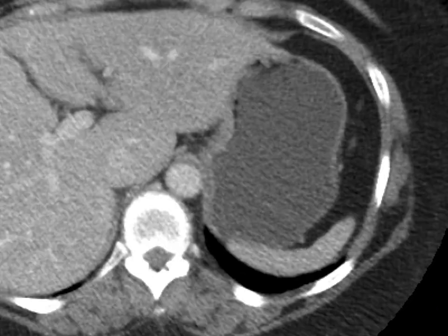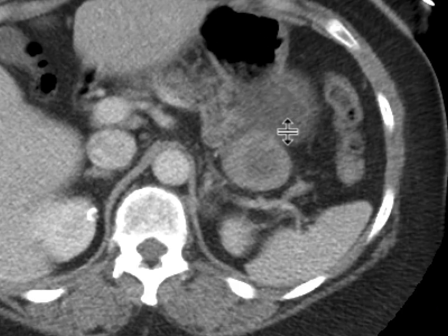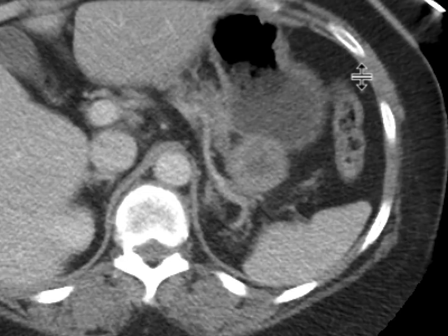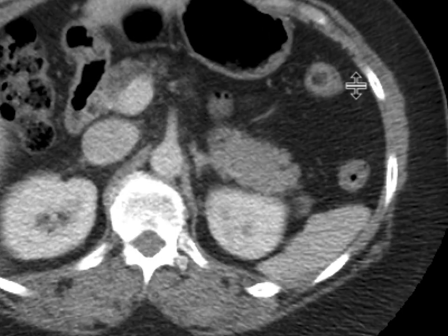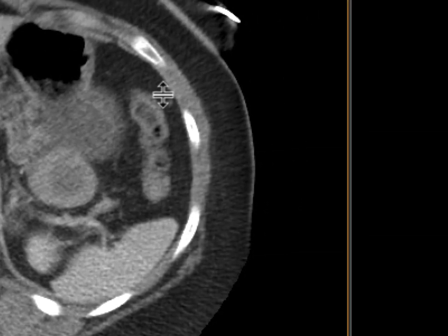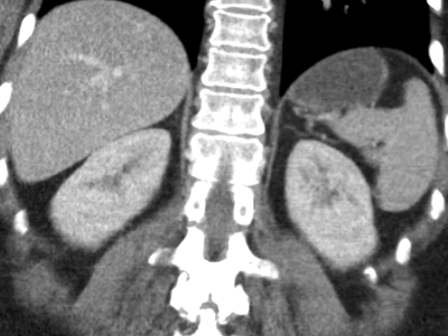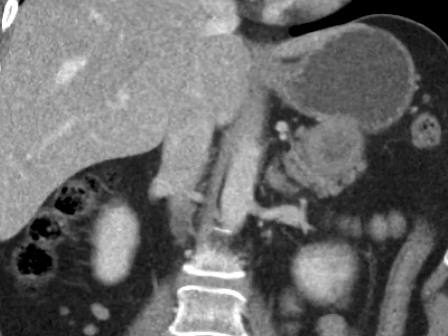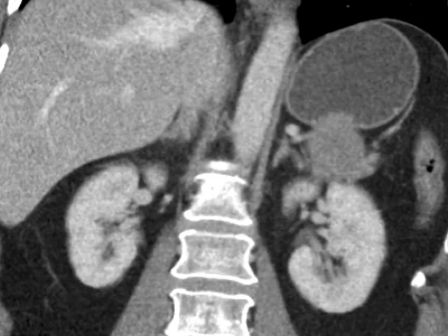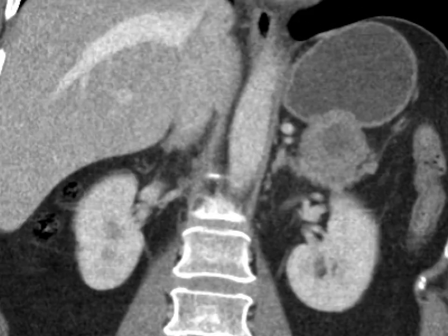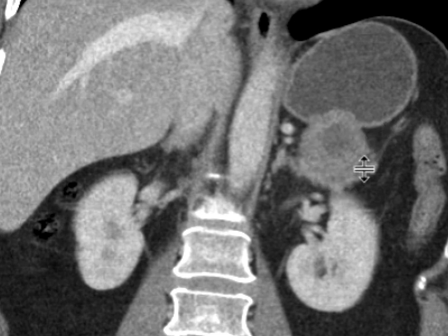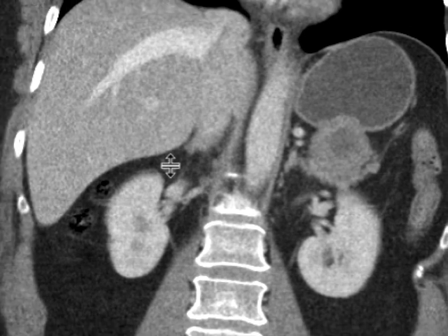As we scroll through this, we can see that there's a mass here in the left upper quadrant. It looks like it's interposed between the stomach as well as the tail of the pancreas. Looking at the mass from the coronals, it becomes a little bit more apparent that it's likely arising exophytically from the stomach and growing downwards, where it's intimately associated with the pancreatic tail.